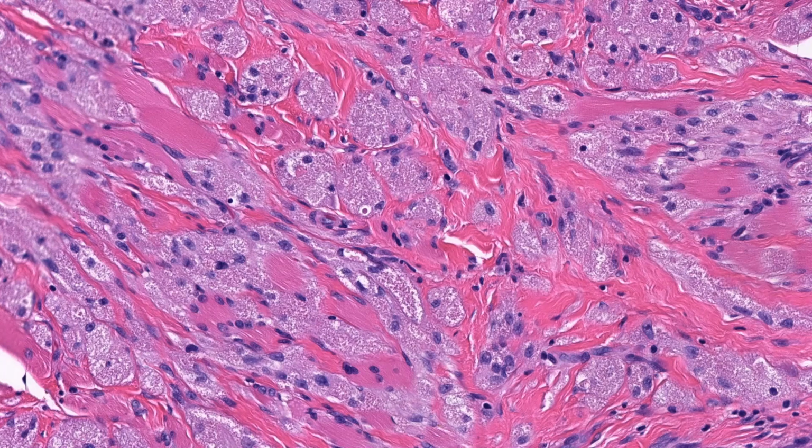Once you're done describing what you see, the final step is to say what you think the diagnosis is, or give a differential, and discuss any immunohistochemical stains or molecular testing that you would order to confirm your diagnosis. In this case, I would say that I feel pretty confident that this is a granular cell tumor. As for the differential, there isn't really much else this could be, especially if I knew the patient age and tumor location.